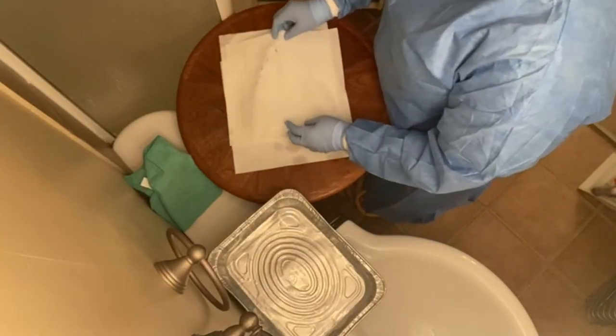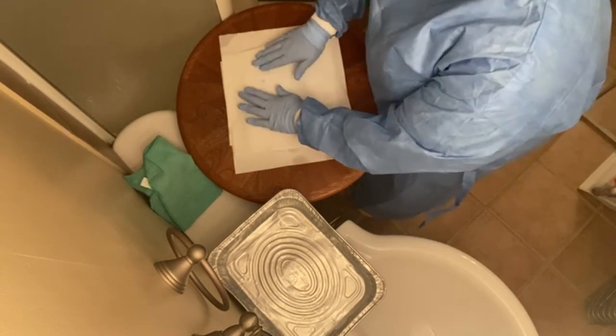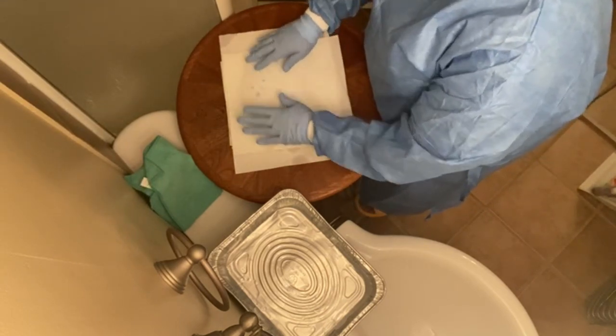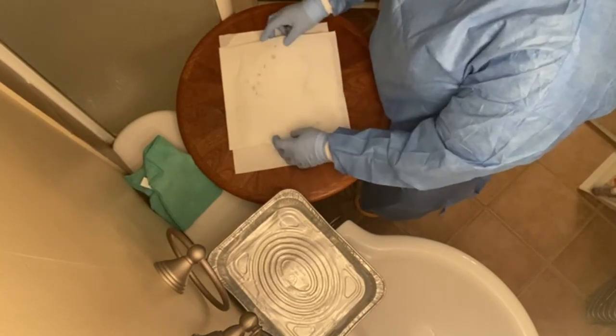Allow instruments to air dry or use a sterile cloth to wipe them dry. Ensuring instruments are dry prevents moisture from interfering with the sterilization process and reduces the risk of corrosion.